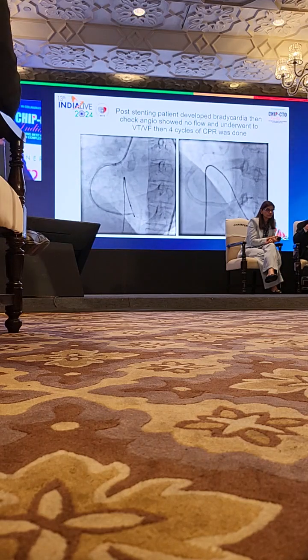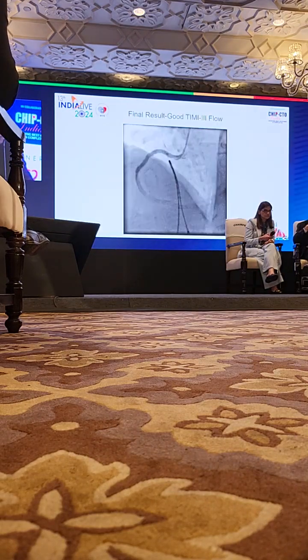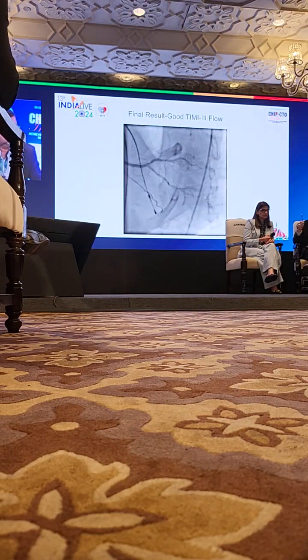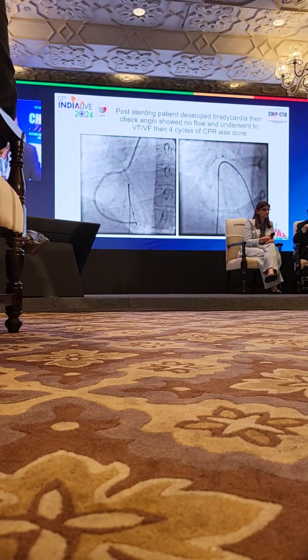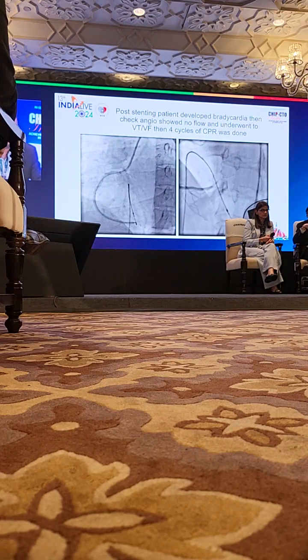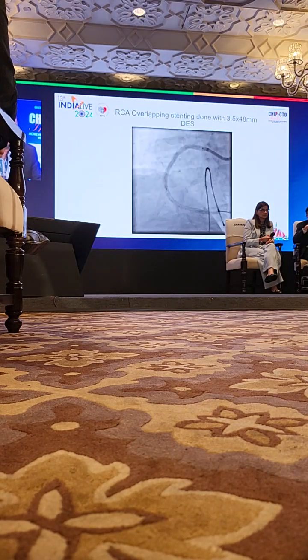In the record there was nothing like AR. No, you will not see it, because once you lifted the catheter, it will come down. You go back. What happened? That is acute transient AR producing hypotension, bradycardia, everything. That caused all these things. That is the cause for the no reflow. During the procedure when using the AL, see how the catheter is sitting on the wall.